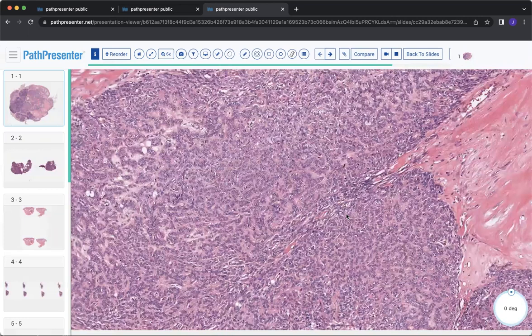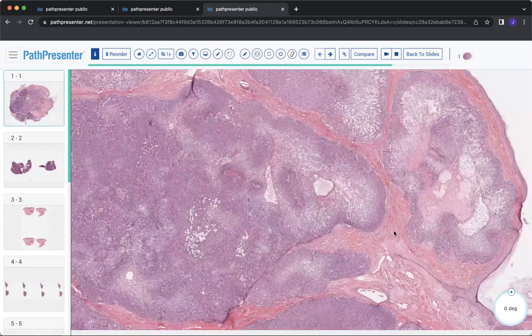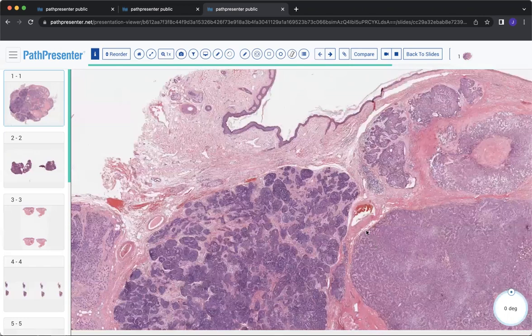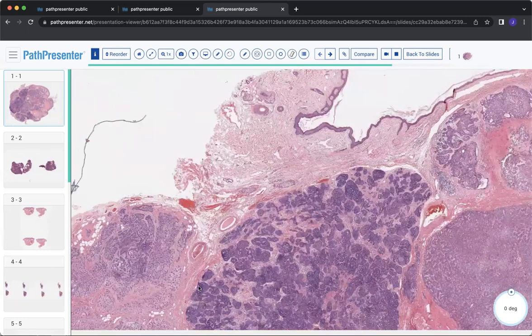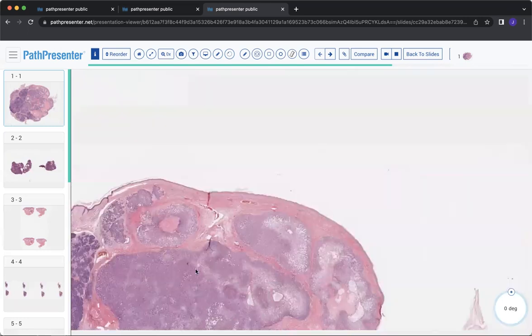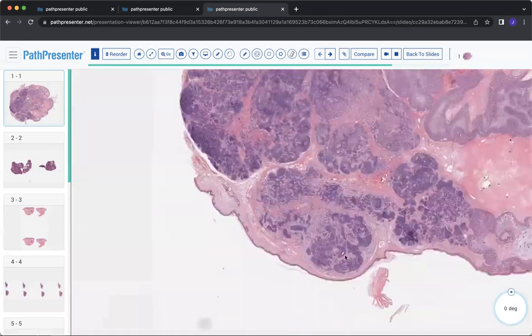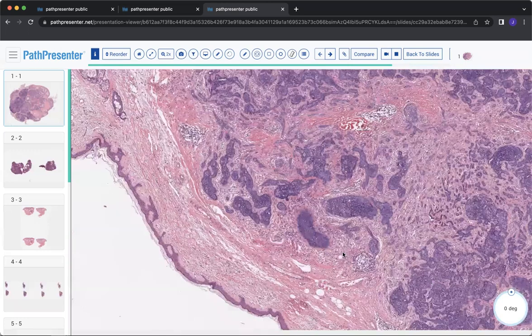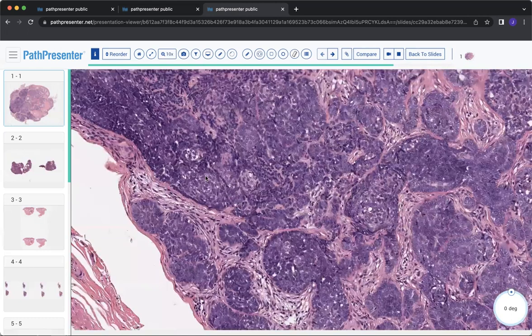So this, to start out, is just to give you the most primitive neoplasm, and technically they're benign, but in reality, if this thing is growing, it only takes one cell to undergo malignant transformation. So at the end of the day, this is large, it's growing, and you've got to excise this and get negative margins just to make sure. Excision with negative margins is going to be the most useful because you don't want this thing recurring later and developing a malignant population.